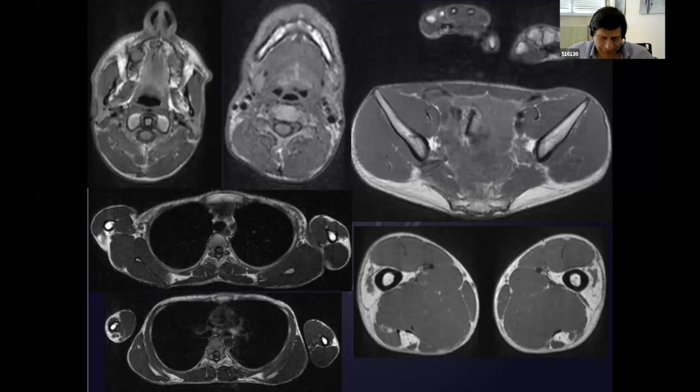Pierre Carlier is more confident with this subject, but in my opinion, now we have the tools, and we have the magnet systems able to perform Dixon techniques, so we can perform fat percentage quantification in select muscles, because all diseases do not have the same distribution in muscle, and some muscles are more important in follow-up in some diseases than in others.